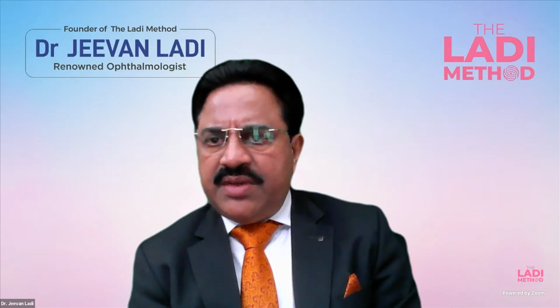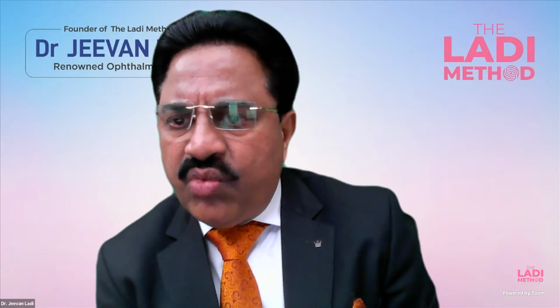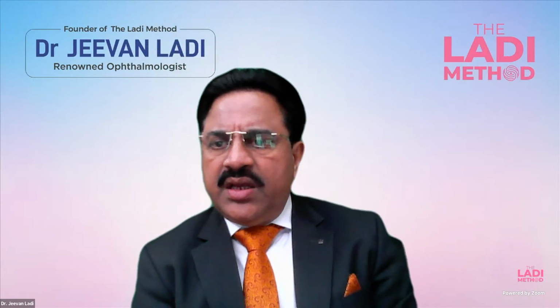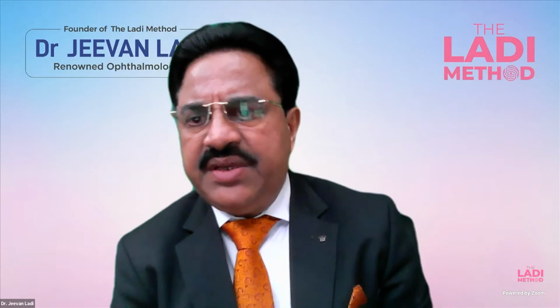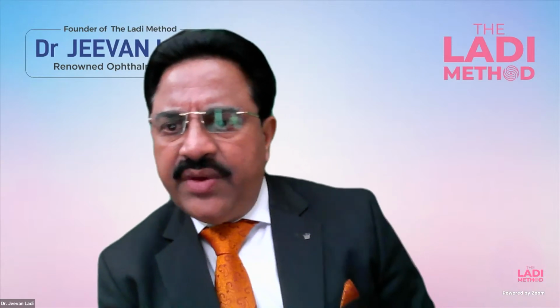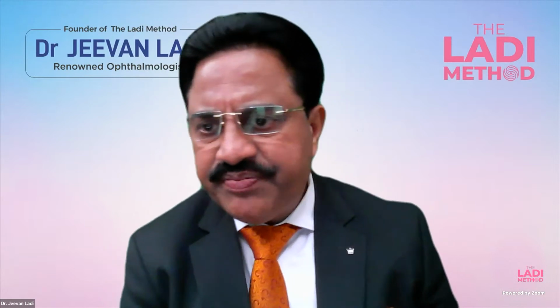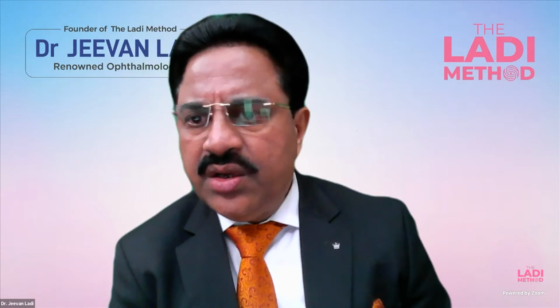There's a question from Dr. Nanda Paransi from Maharashtra. Many A-scan machines have integrated Barrett formula. Was the machine you use had this integrated? No. In our machine, Barrett formula is not integrated. And I feel it's going to give us spurious readings. The reason being that though you have a Barrett formula on your machine, unless this measurement of 200 micron is adjusted, it's very difficult to get the readings more accurately in a premium IOL.